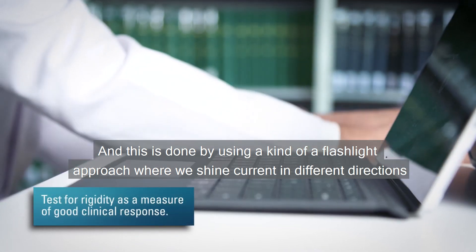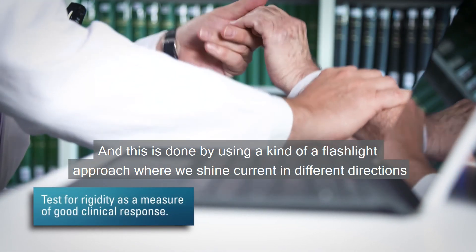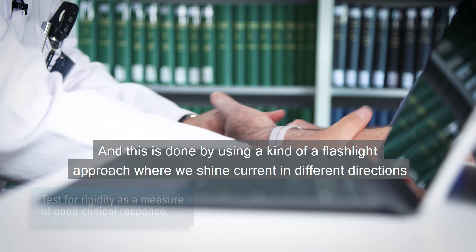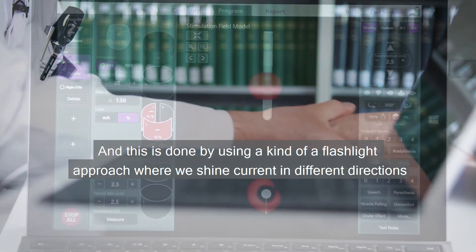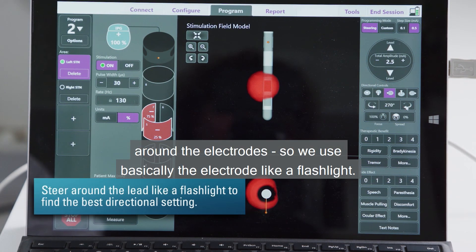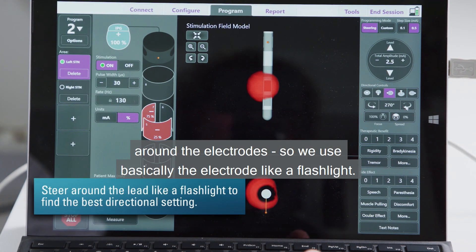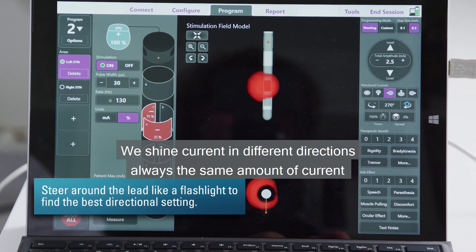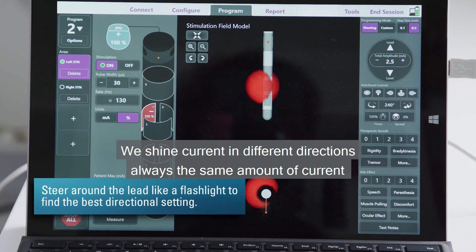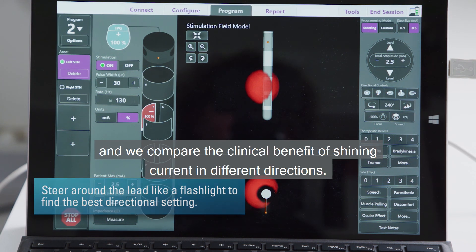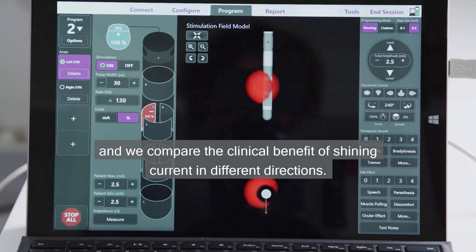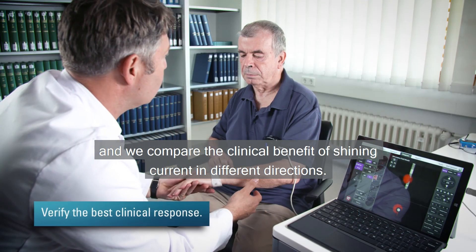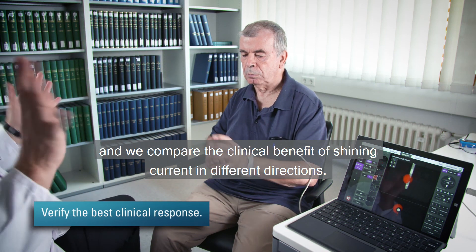And this is done by using a kind of flashlight approach where we shine current in different directions around the electrode. We use basically the electrode like a flashlight, shining current in different directions, always the same amount of current, and we compare the clinical benefit of shining current in different directions.